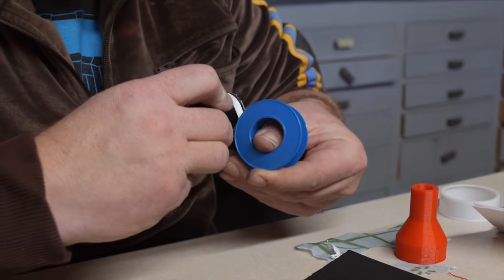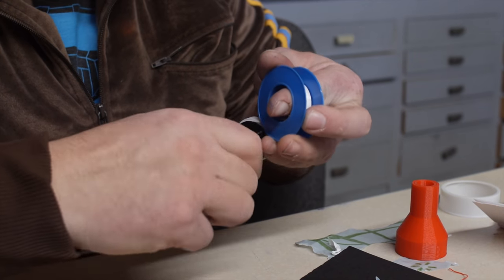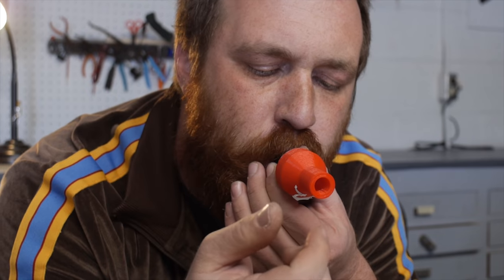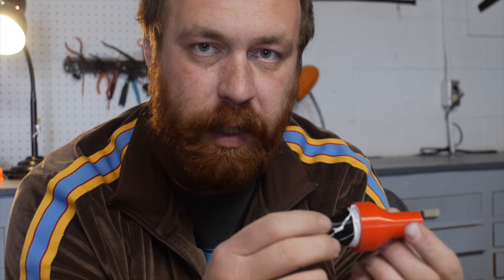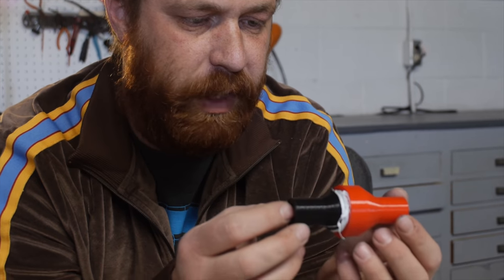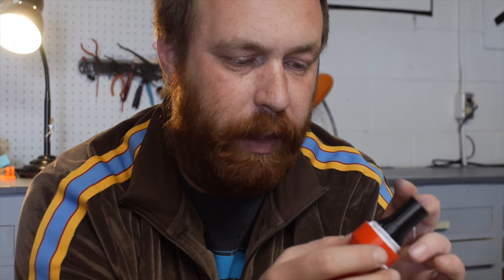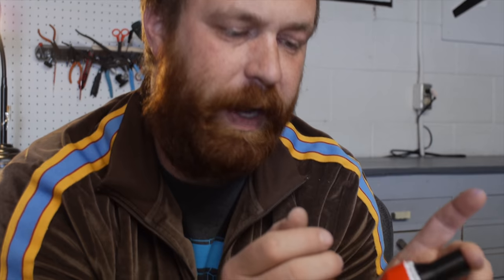My figuring is this is probably not kosher for hospitals, but if it's in our food supply, I am okay using it in an emergency situation. Yeah, we got it. Okay, so I think what I'll do is put some hose barbs on these sides so it can be connected to other machinery. Maybe this is 25 cents worth of plastic pieces. It would be fun to keep working on the rest of a respirator, but other people are working on it, and let's give them some valves.